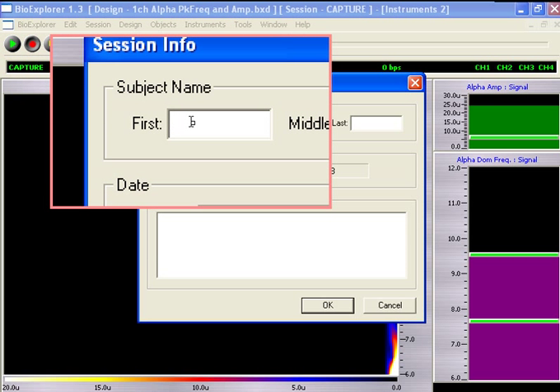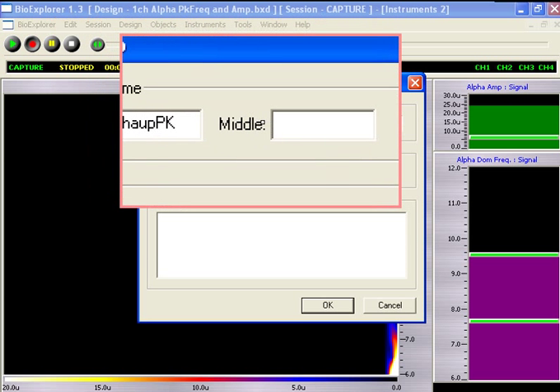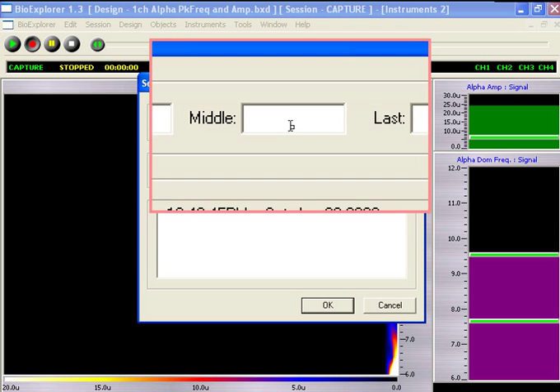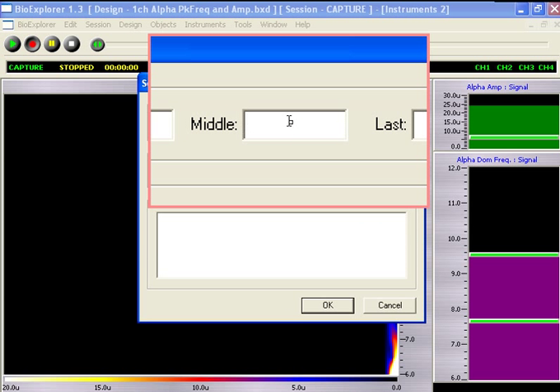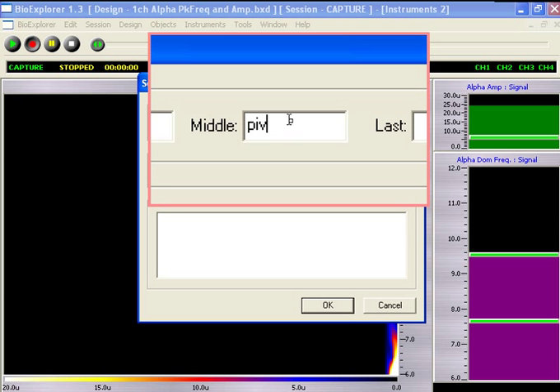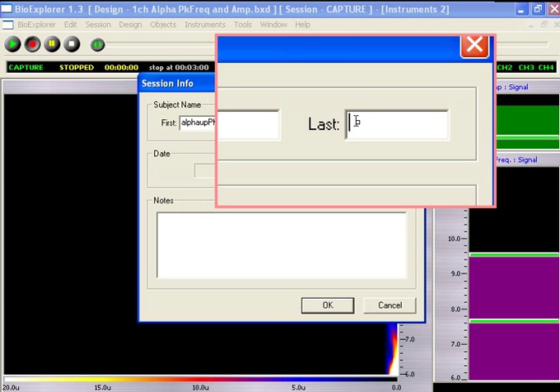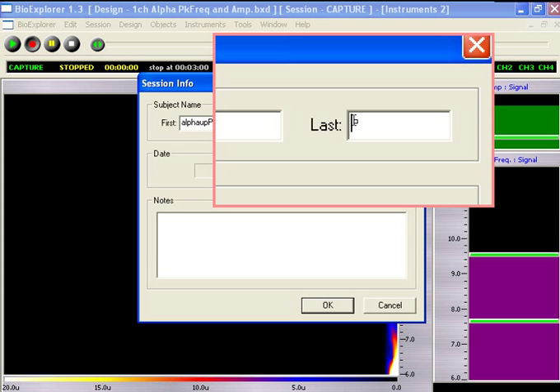In the first field, we'll enter the name of the design. In the next one, we'll enter the sensor montage using Roman numerals if necessary because Arabic numerals won't be saved here. And this last field will enter identifying initials.